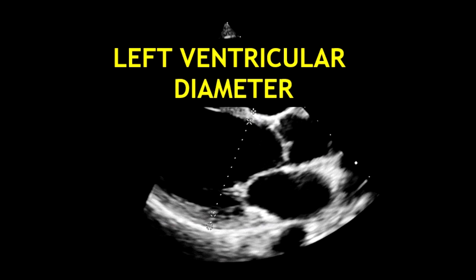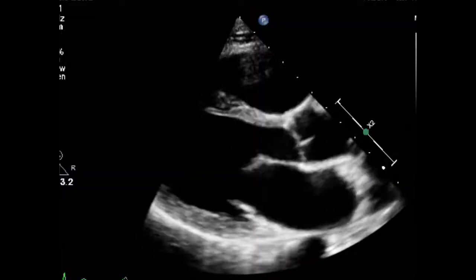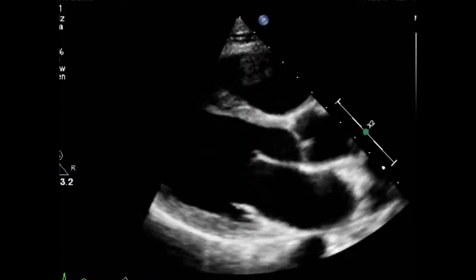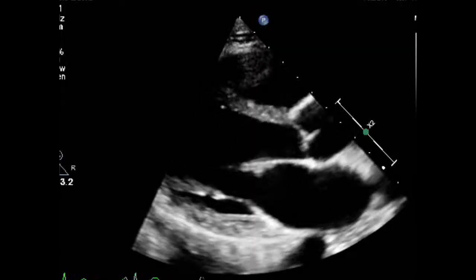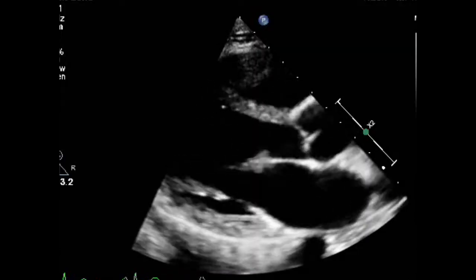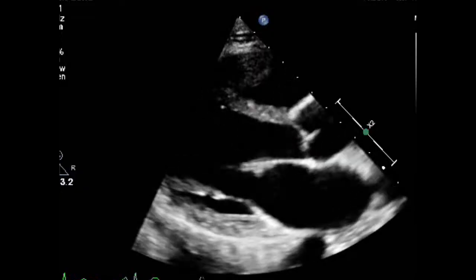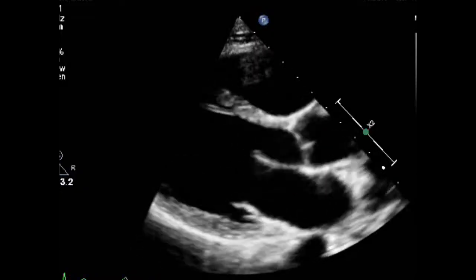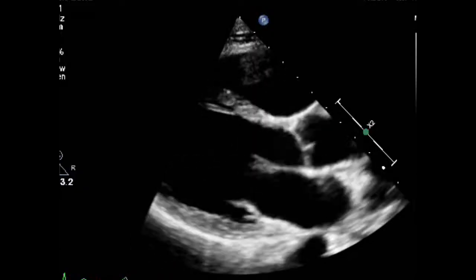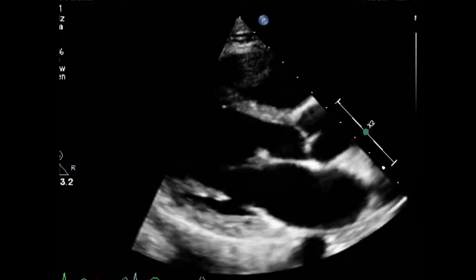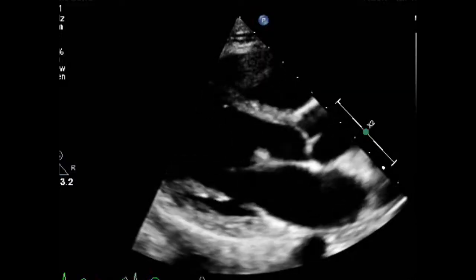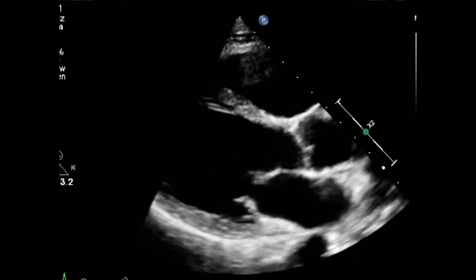Hello, in this video I'm going to show you how to measure the left ventricular diameters. We can measure the diastolic and systolic linear dimension in the parasternal long axis view. By doing this, we can have an estimation of the left ventricular size and function.